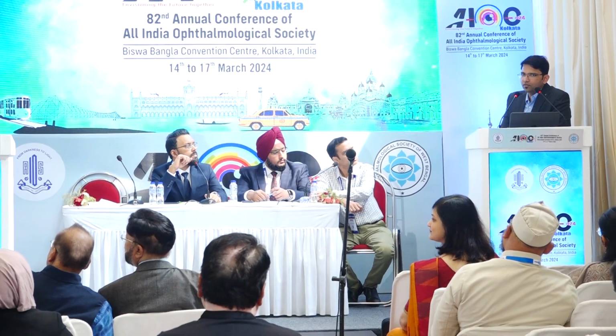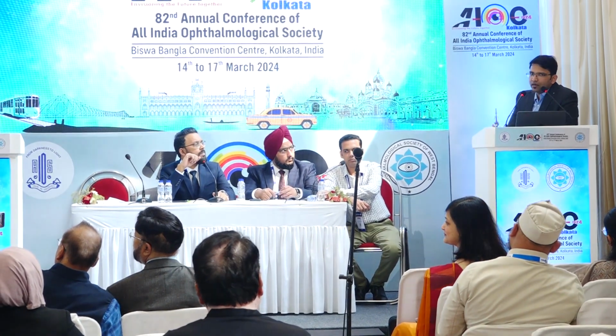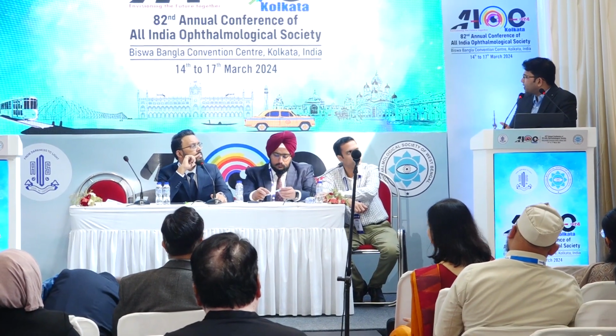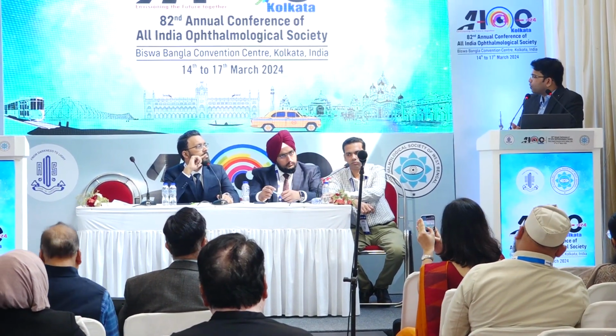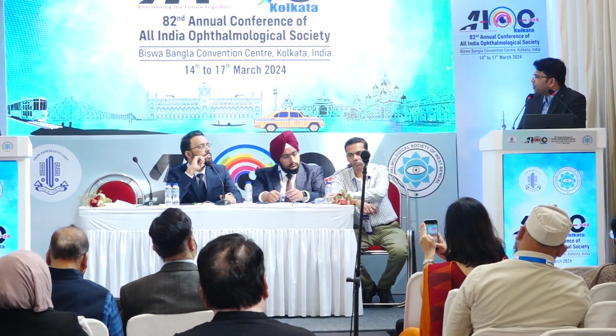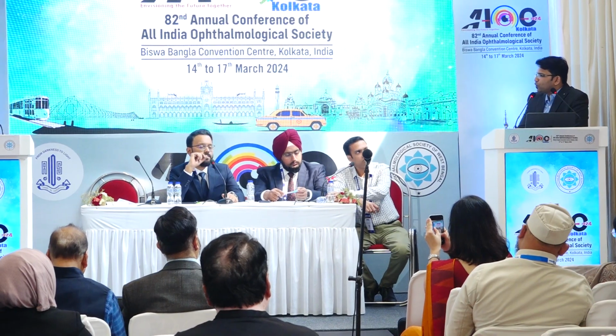If there is no retinal detachment, then it will depend on a case-to-case basis, if it is inferior. So in the first patient, we were able to clear the majority of the tissue around the incarceration site, and I initially thought that even C3F8 gas could be put. But then I ended up putting oil only because we should err on the safer side. You saw in the post-op period, despite putting oil, there was retinal fibrosis, and in the second case also a linear tractional fold started developing between the wound and the disc. So you end up having a lot of PVR in these cases, so it is important that you put silicone oil.